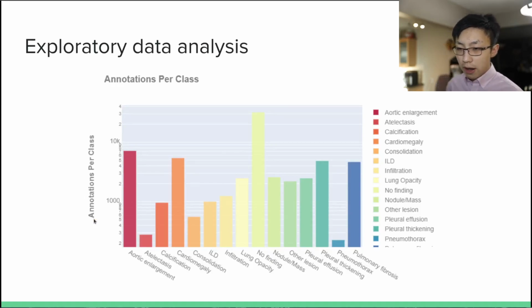Let's take a look at a few graphs. First of all, we observe a significant label imbalance within the annotations of abnormal chest radiographs. As such, we desire an even distribution of labels across our validation. We use multi-label stratified k-folds based on the abnormal labels in order to validate our model. We can also consider using a class-aware sampler, such as synthetic minority oversampling, also known as SMOTE, but we didn't see a huge performance uplift in that to justify the computation.